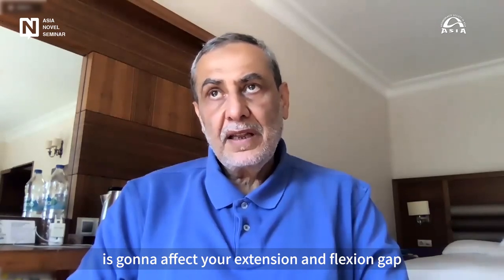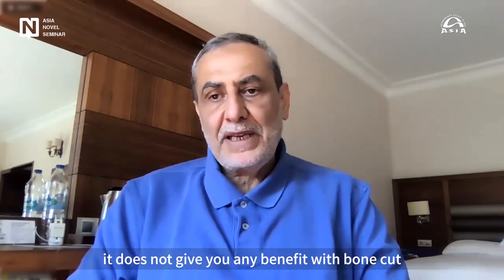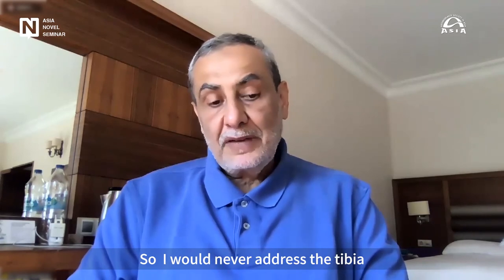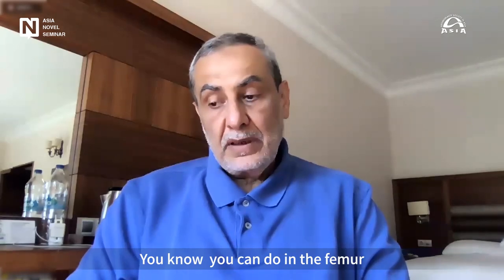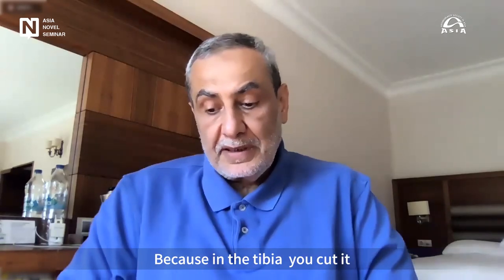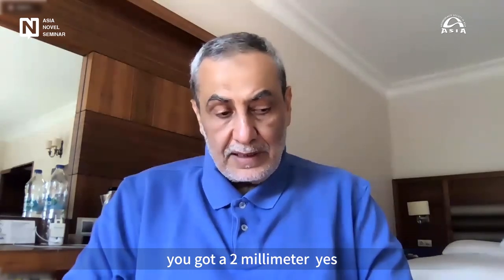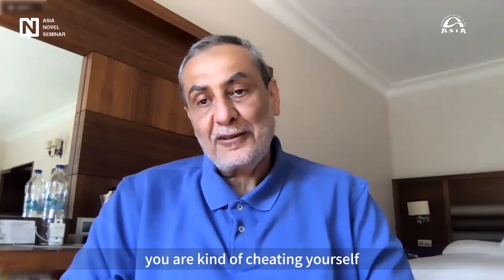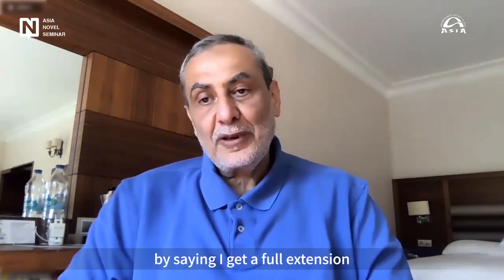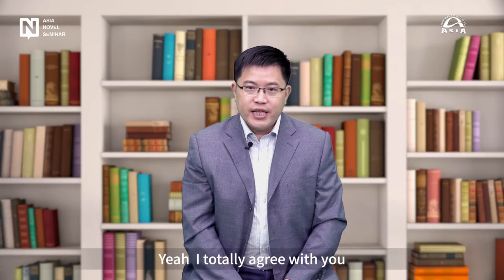Proximal tibia never, because removing extra bone from the tibia is going to affect your extension and flexion gap. In other words, it doesn't give you any benefit with the bone cut. So I would never address the tibia. Leave the tibia alone. You can do it in the femur, but in the tibia you cut 2 millimeters, and you're going to have a 2 millimeter looser flexion gap as well. So you're not gaining. You're kind of cheating yourself by saying, I've got full extension, but I now have a more unstable flexion gap. Yeah, I totally agree with you.